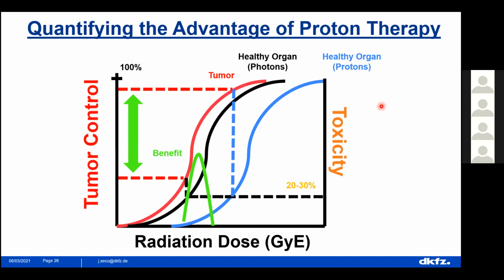The fact that I can reduce the toxicity of my treatment means I can really dose escalate to the tumor and achieve better control. This is the most important figure of my presentation. If you understand this figure, you understand how particles work.